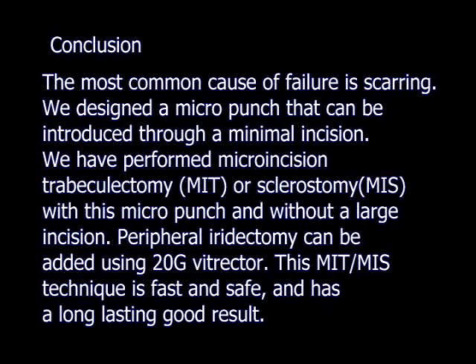In conclusion, we designed a micro punch that can be introduced through a minimal incision. We developed micro incision trabeculectomy, or MIT, with this micro punch and without a large incision. Peripheral iridectomy can be added using a 20-gauge vitrector. This micro incision technique is fast, safe, and has long-lasting results. This technique will become another standard technique for glaucoma surgery. Thank you for your attention.